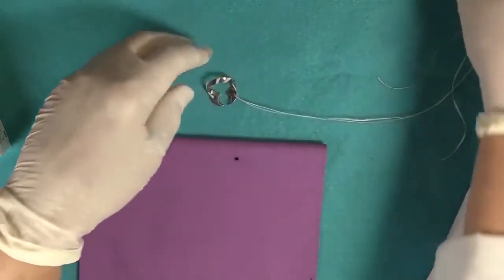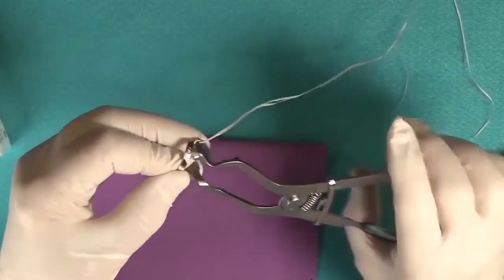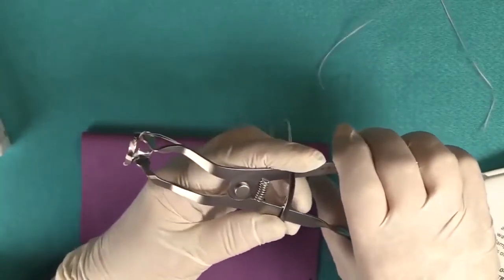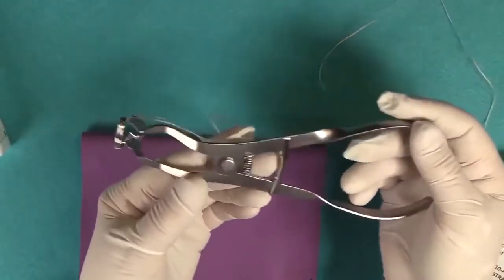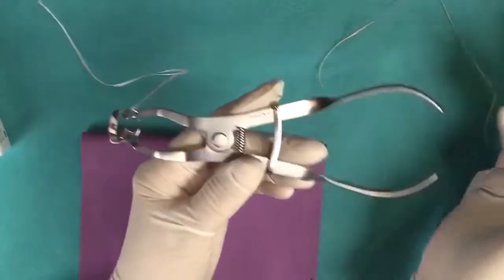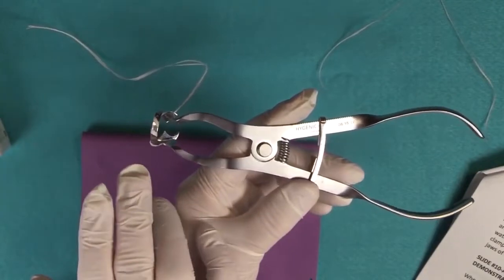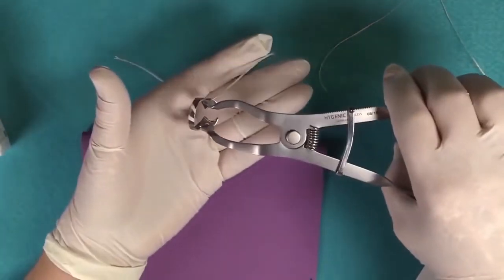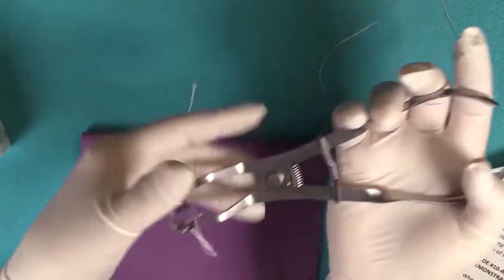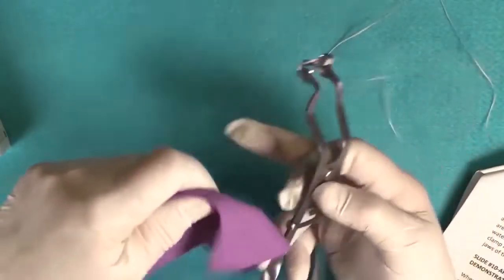Here we go. I find the easiest way to do this is to engage my clamp. By the way, I know some of you get confused sometimes on how to put the clamp into the forceps, so let me show you a little trick here. I always place the clamp in the forceps so the bow is up, facing me. Whether I'm on the lower arch, I'm palm down, and when I'm on the upper arch, I just turn the forceps over and I'm palm up. So you don't have to be switching things. Always load it the same way.